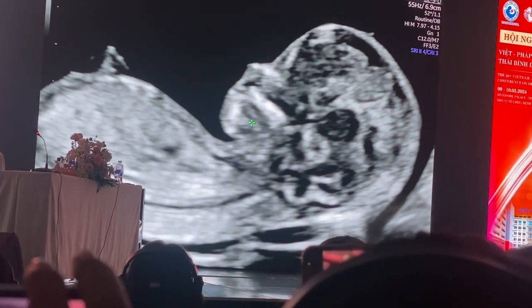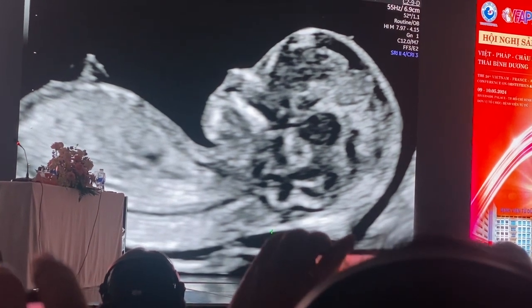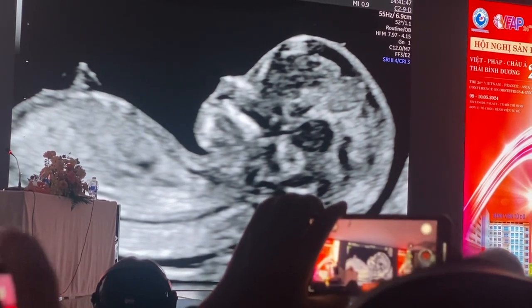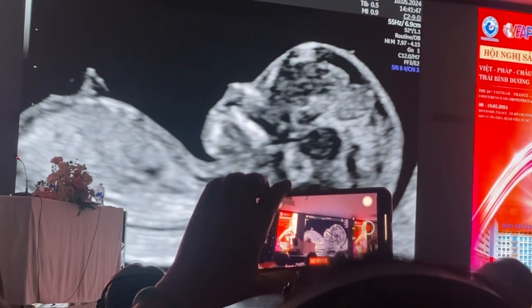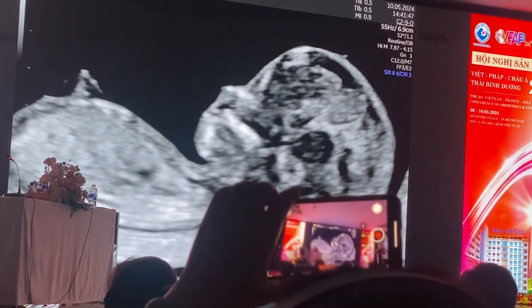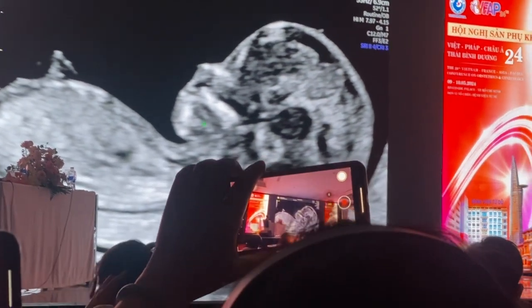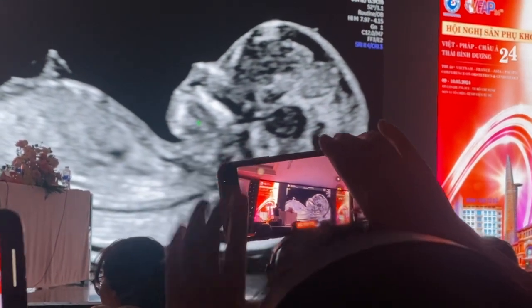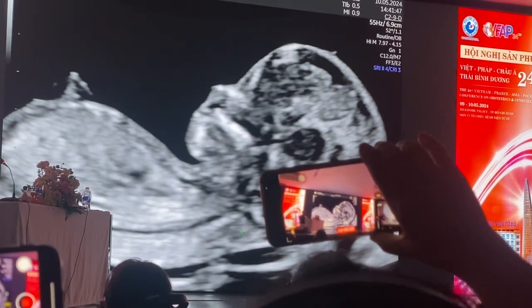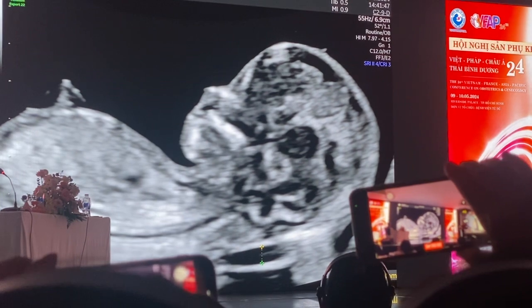And then I can press calc, and I can press the nuchal translucency, and I place the transverse bar of the nuchal translucency over the skin line, and then I drop it vertically down with the transverse bar covering. So I'm just measuring the fluid, and then I press enter. So I just measure that again. I press there, transverse bar, just measuring the fluid, and transverse bar.